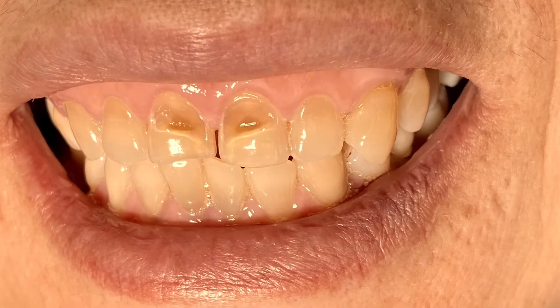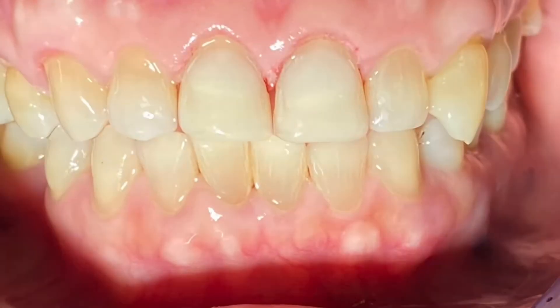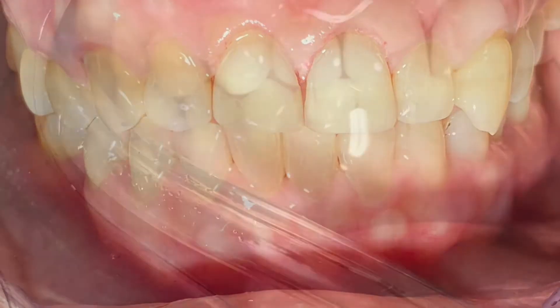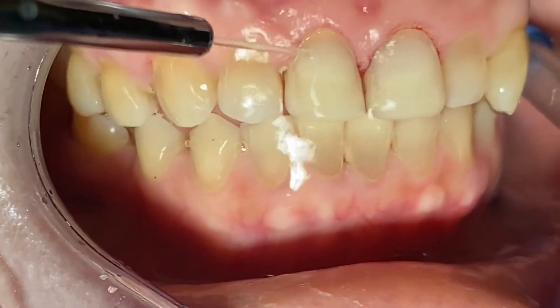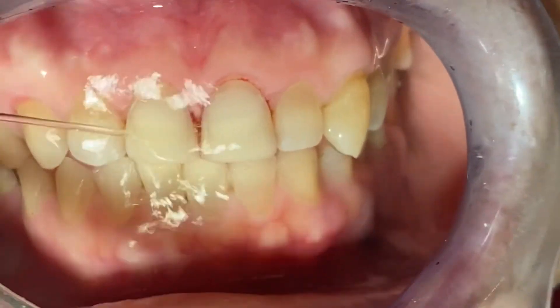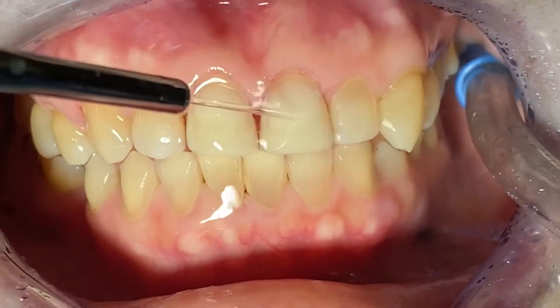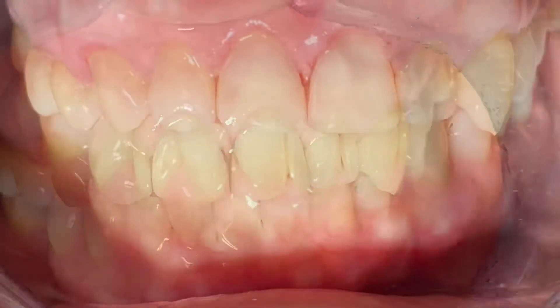So what we have done for her is simply a composite veneer — no anesthesia necessary. What we did was we roughed the area, etched the tooth, put bonding, and applied composite layers on those teeth.